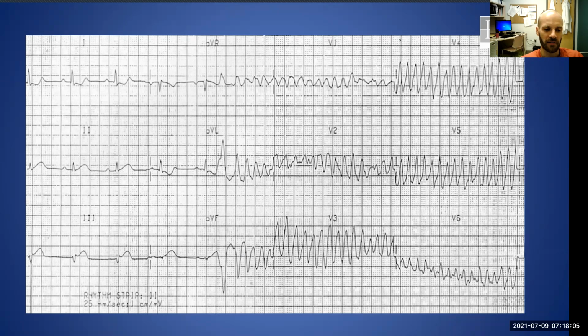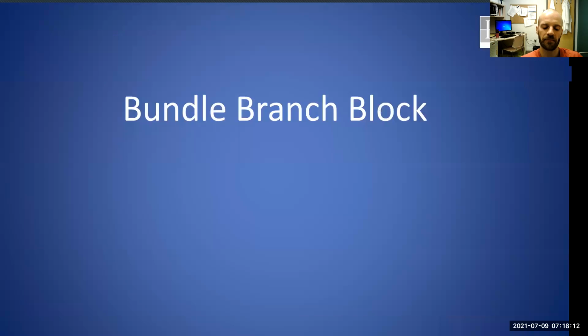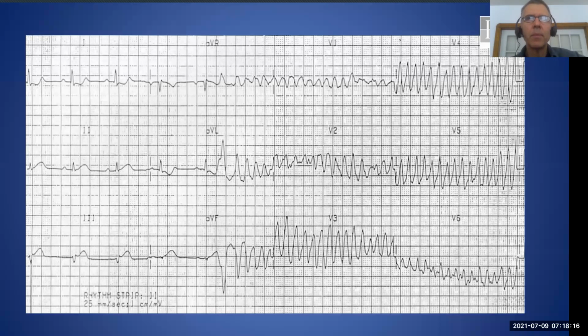So we've got ST interpretation and rhythm interpretation all in one go. We're starting to build these things up. Excellent. Good work, guys. So I have a question. Yeah, Claude, go for it.